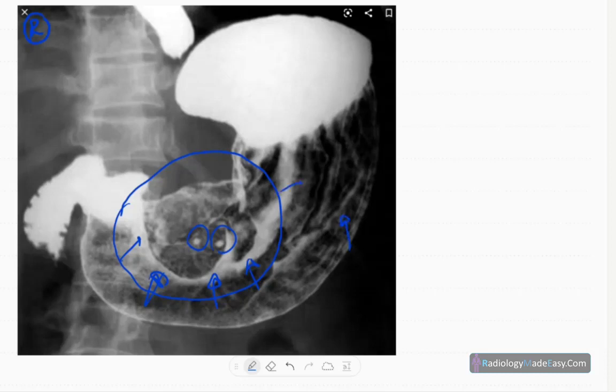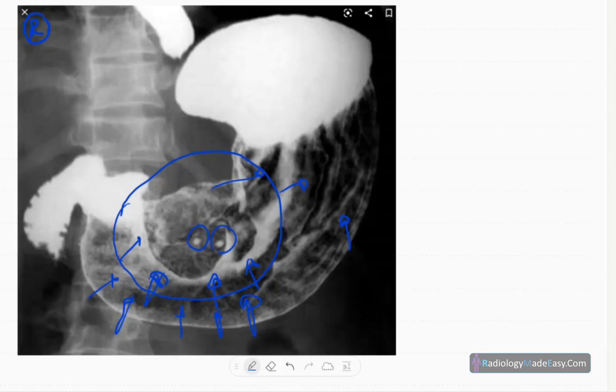Here you can see the rugae are also thickened. In these areas, you can't see any ruga pattern because of this lesion. The ruga pattern is most likely disrupted, and you don't see any synchronous lesion elsewhere.